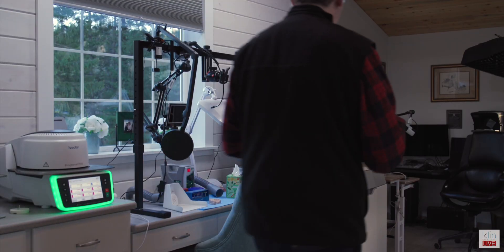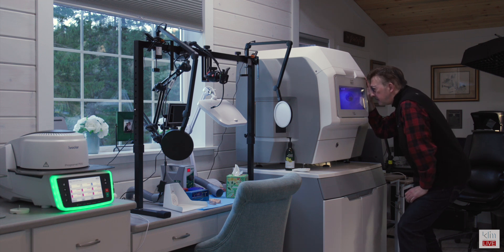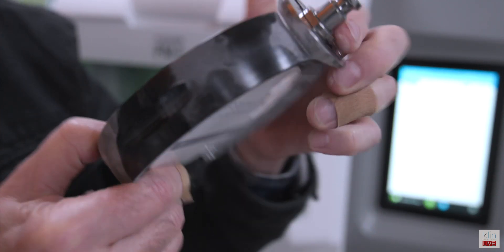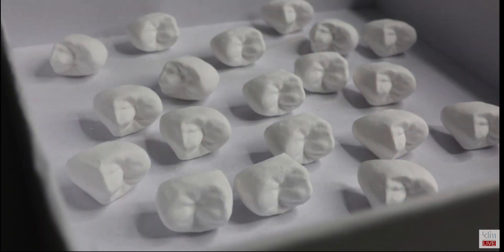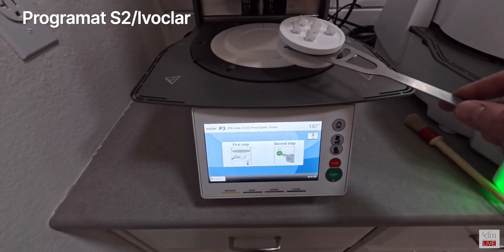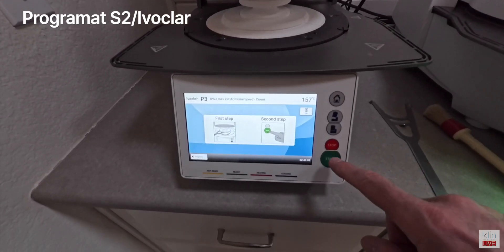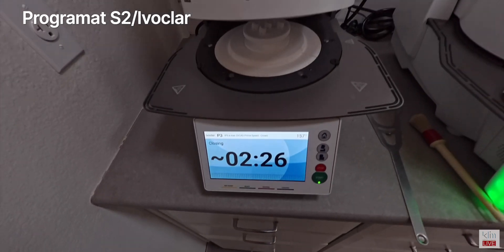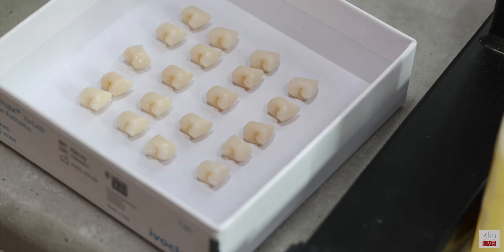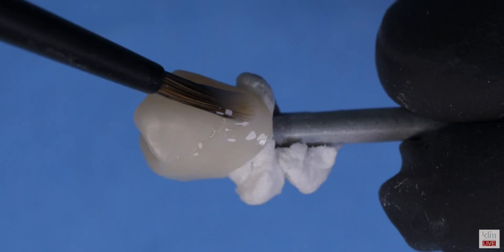The next morning, a successful mill was confirmed. The next step was to process the zirconia — you can see the mill is excellent using the refined mill process; they're impeccable. The anatomy is there and there's not a lot of finishing needed at this step. We're going to place those restorations in the program at S2, using a zirconia sintering cycle to optimize the Prime Aesthetic. Chair side with the Prime, we can do this in 15 minutes in the CS6 — a longer cycle will optimize the aesthetics.